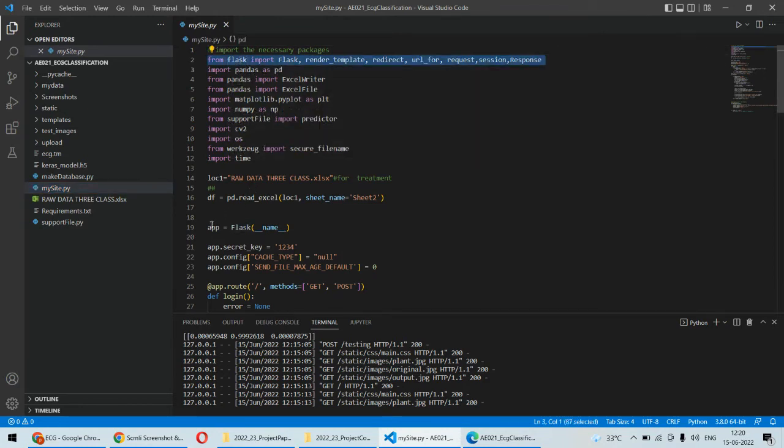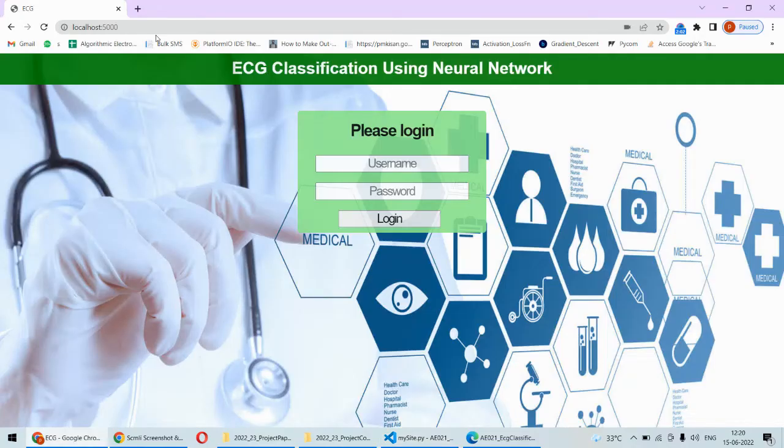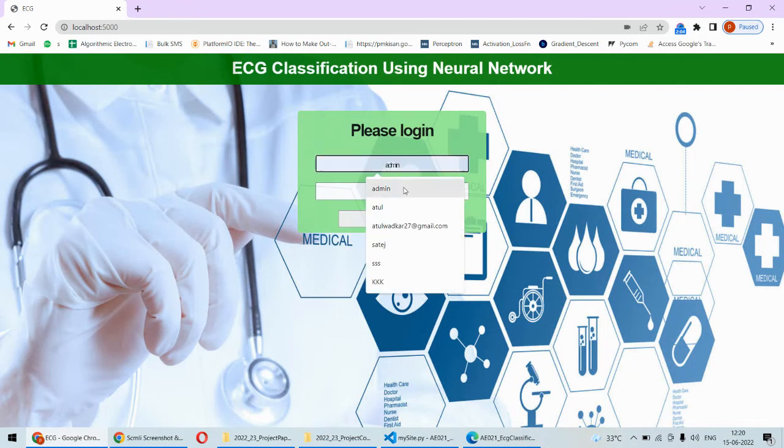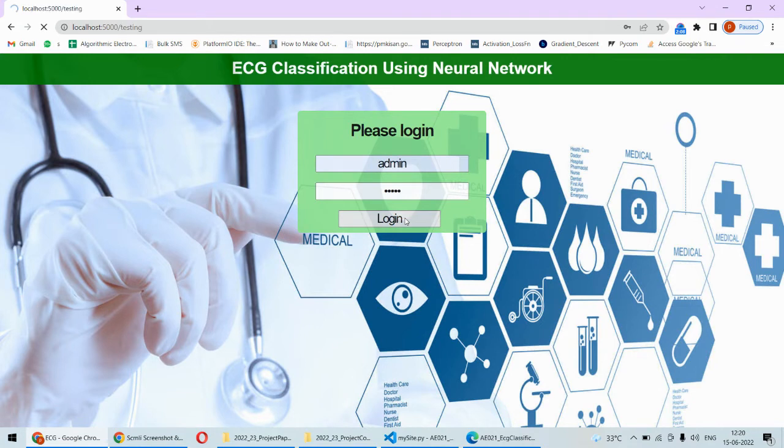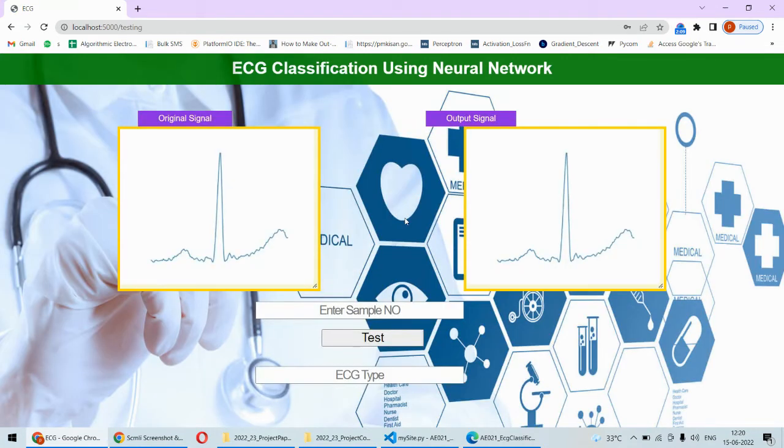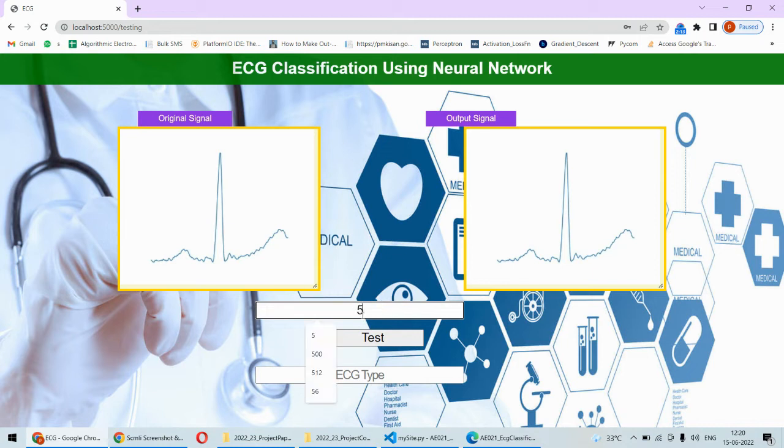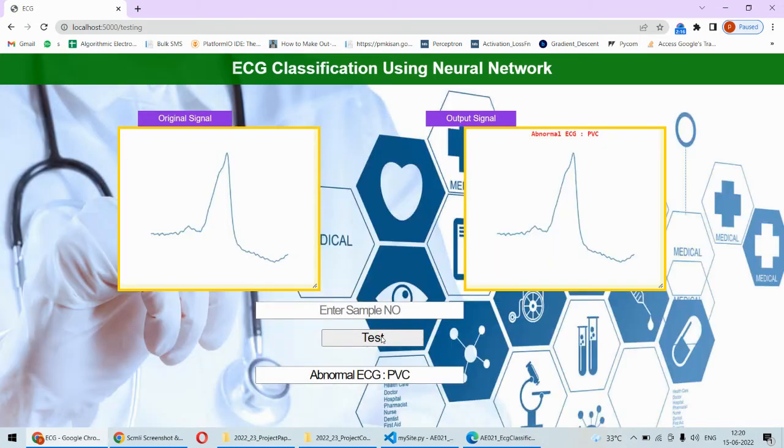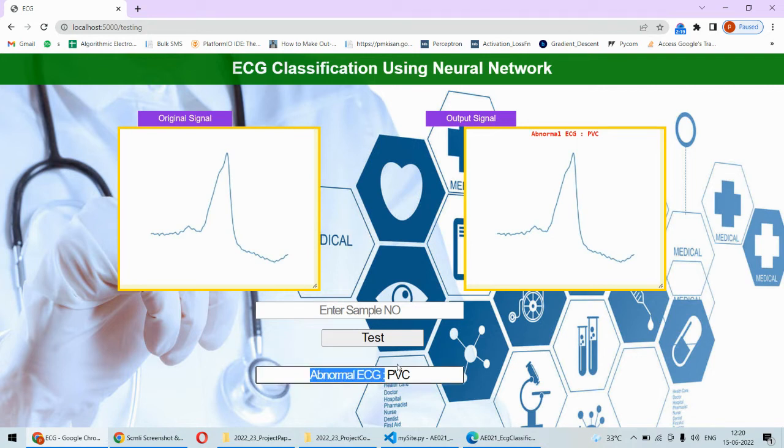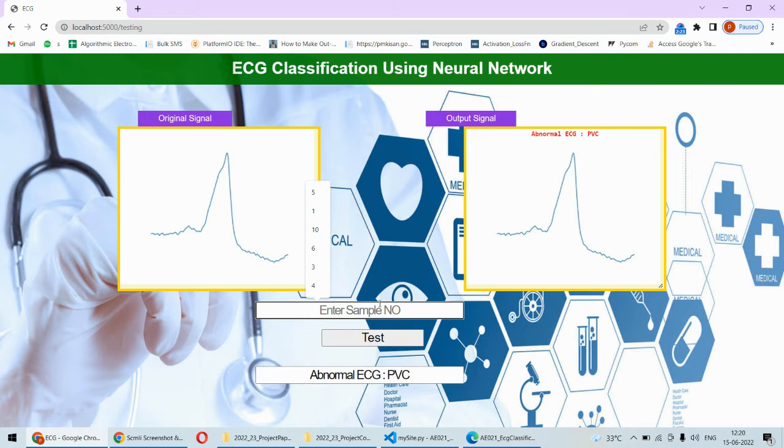Now let's see, after running the code we can open the application. Then we need to type the username and password, so it is admin admin. Once you log in it will redirect to this page and then you need to put the sample number. For example, if I put 5 as a sample number, it will load that sample and this is clearly abnormal ECG, PVC ECG detected which is abnormal.